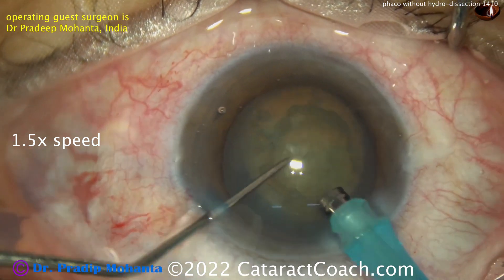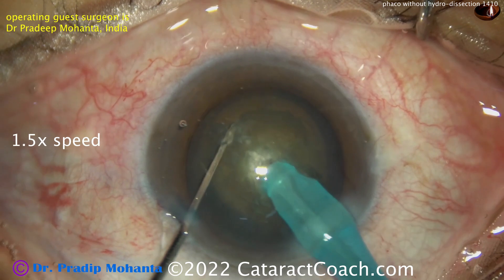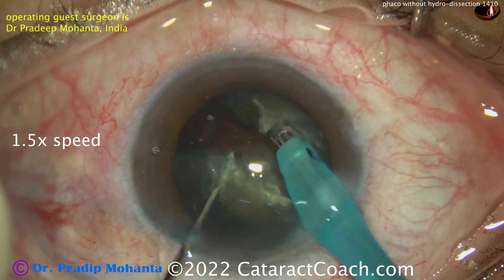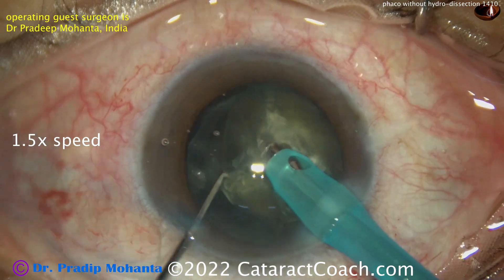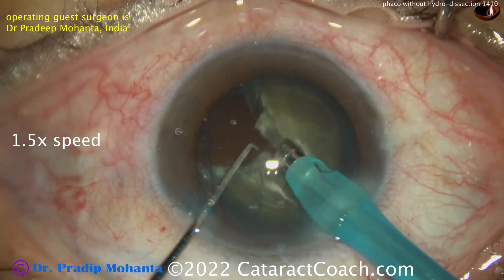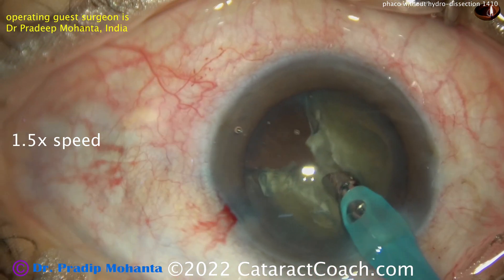Using the phaco probe, and here comes the chopper — or a Sinsky hook. Remember, a good surgeon can chop with almost any instrument; it doesn't have to be a specialized chopper. Here's the chop and the nucleus is split down the middle. That's not going to rotate much, so you chop off another piece, take that one down, then simply pivot the phaco probe to the other side and chop again.